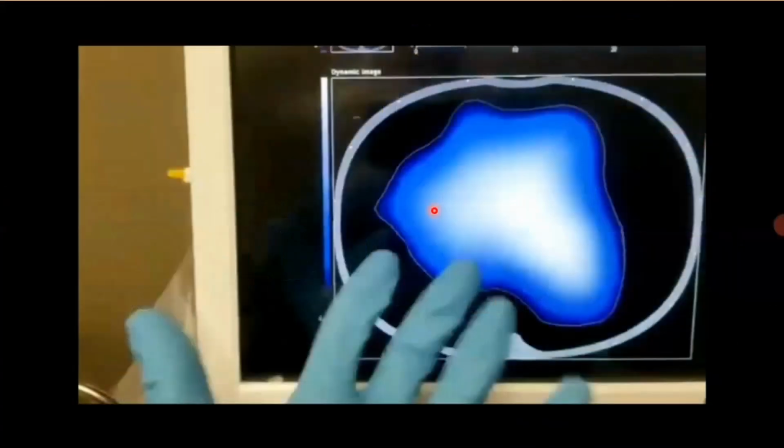I'm going to show you another video to get some more dynamic images in. This is going to be on ACPC with the optimal PEEP set at 8, and then I'll transition to APRV. You'll see the T high and the higher mean pressure that we get with APRV, and you can see the difference in the distribution of ventilation.